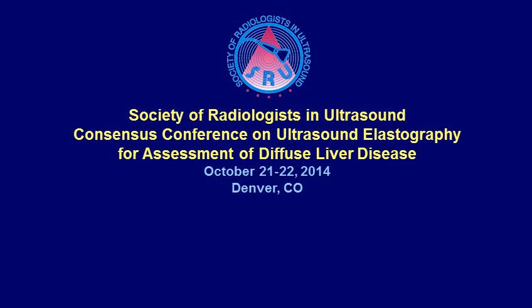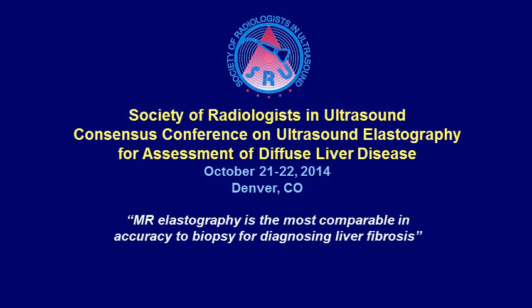A consensus conference was held by the Society of Radiologists in Ultrasound in 2014, and they reviewed the diagnostic performance of ultrasound-based elastography and MR elastography in assessing liver fibrosis. They concluded that among the non-invasive techniques, MR elastography is the most comparable in accuracy to adequate biopsy in diagnosing liver fibrosis.